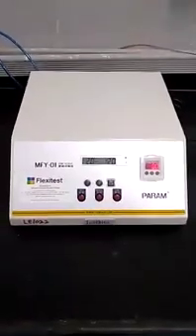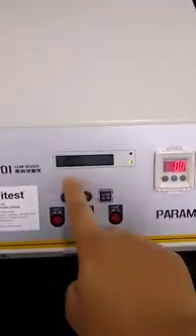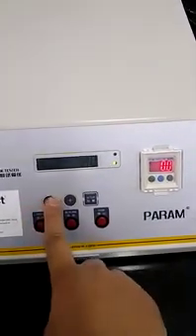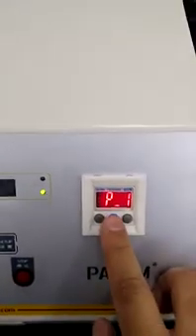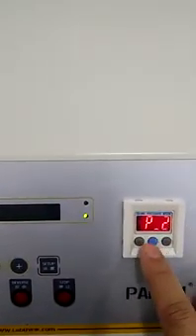This is our machine leakage tester, model number MFY01. On this screen, the hold time is set to 2 minutes, or 120 seconds — you can increase or decrease it from here. For the pressure, P1 is set to minus 49 kPa and P2 is set to 50 kPa.